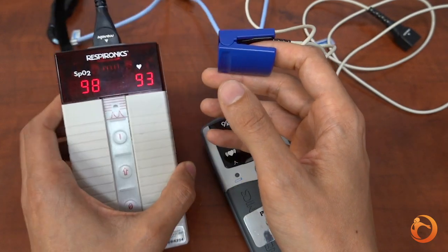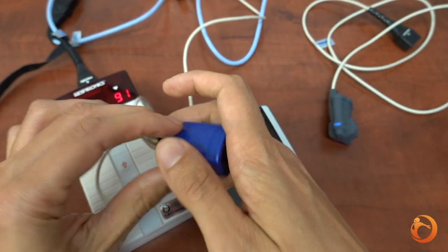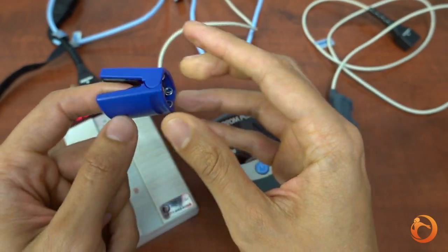If you have problems getting a good signal or a steady reading, try changing the finger, try the other hand or warm up your fingertip beforehand.